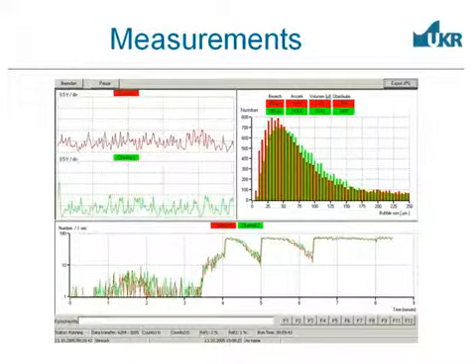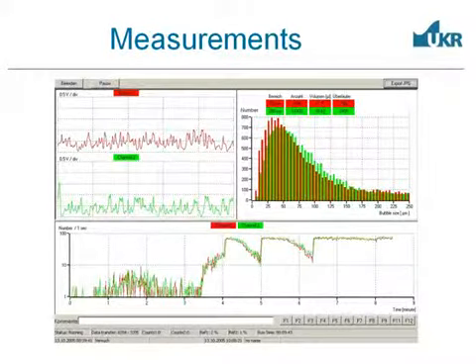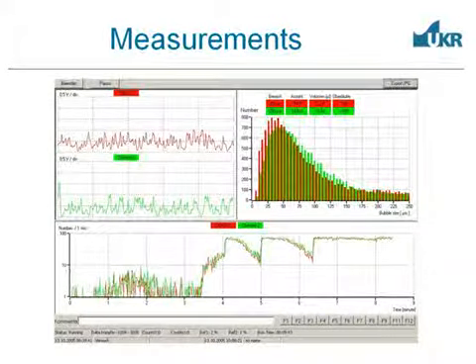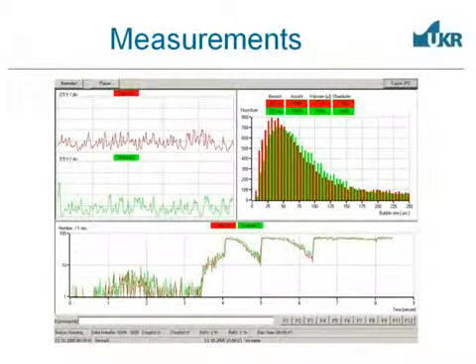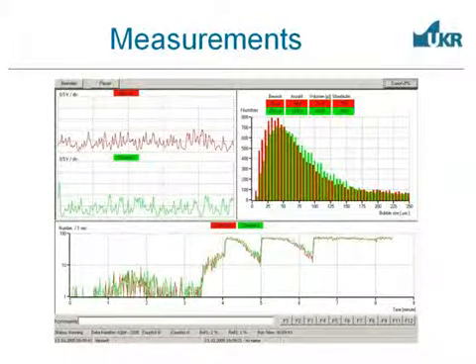So what did we find? The measurements showed that the bubbles were in quite a large spectrum, from very small bubbles up to here. And when you see where the filter sizes were from the meshes, the bubble trap was about here, and the arterial filters were about here. So the majority of bubbles are just able to pass all these filters.